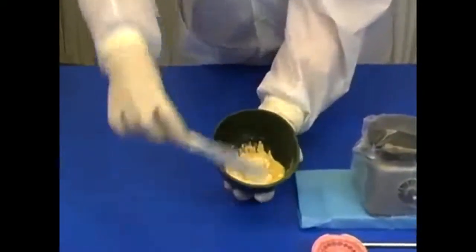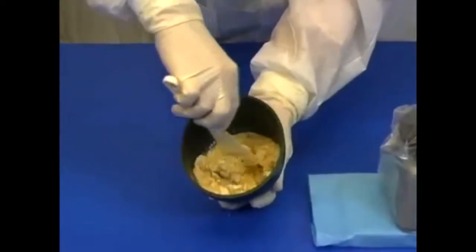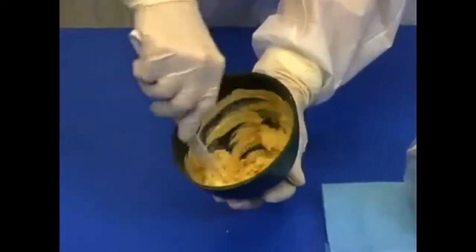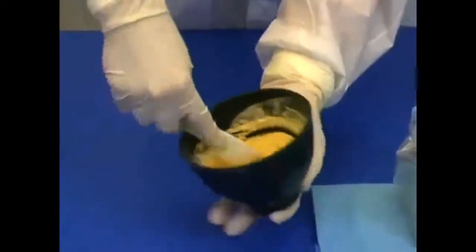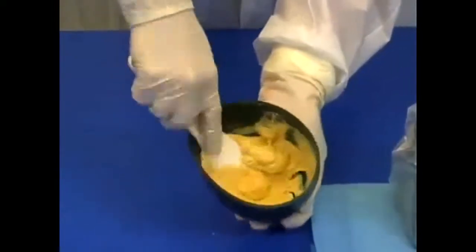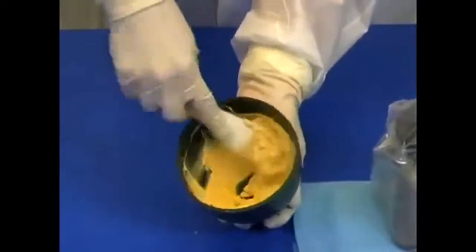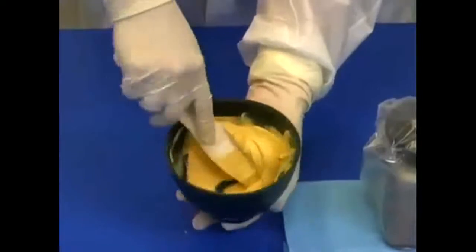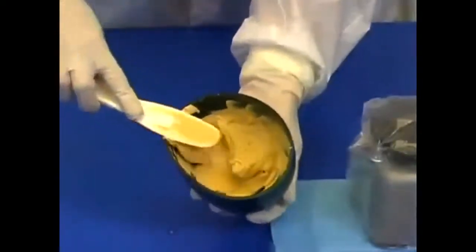Gently stir all the powder into the water to minimize the amount of air trapped in the mix. Vigorously mix by wiping the spatula against the sides of the bowl to incorporate all the powder and remove excess air. This is called stropping. The mixture should be smooth and homogeneous.